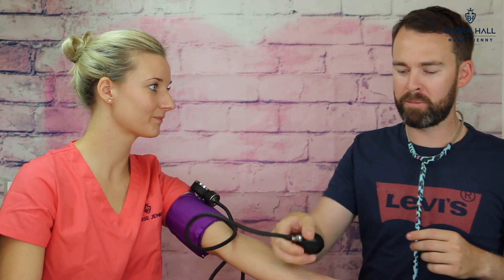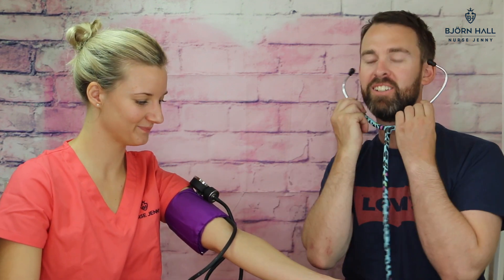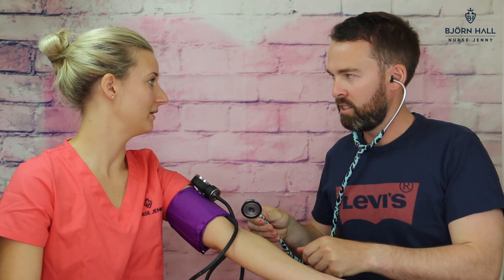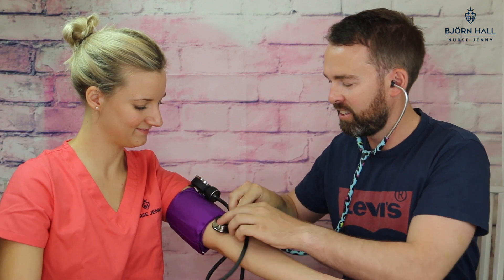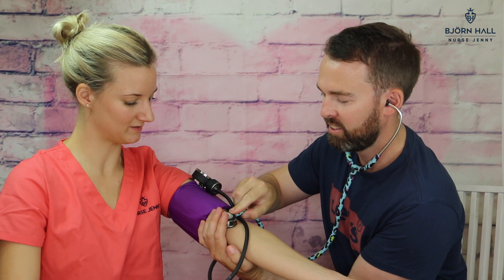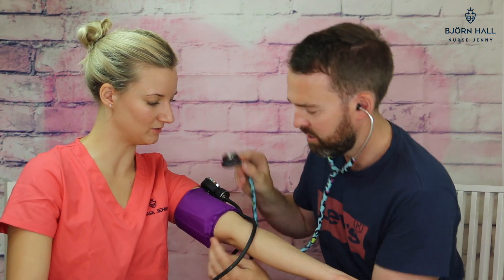Alright, now we're going to do it properly. And you're going to pump it up to? I'm going to pump it up to 130. So put this in — and you've popped it in the right way, yes you have. You don't have to, but I think I did because it was just easier to hold it.